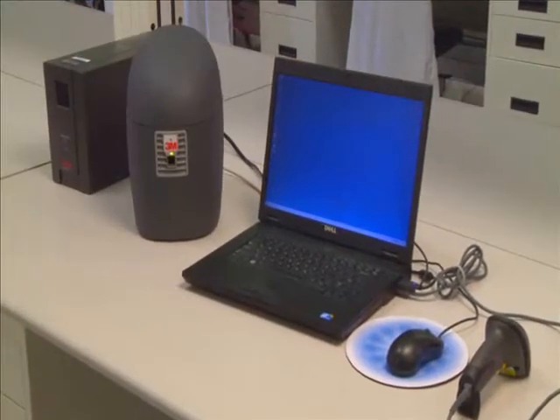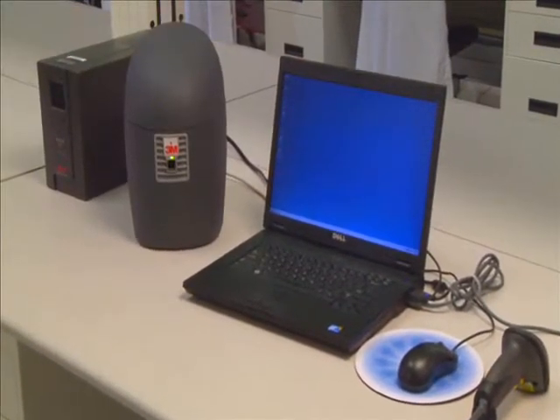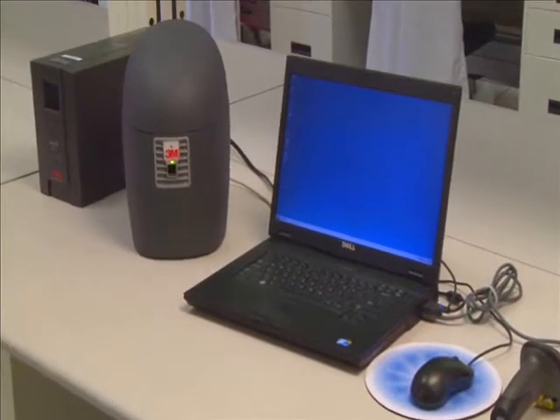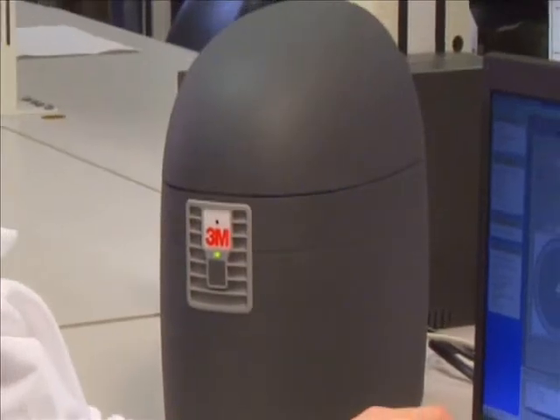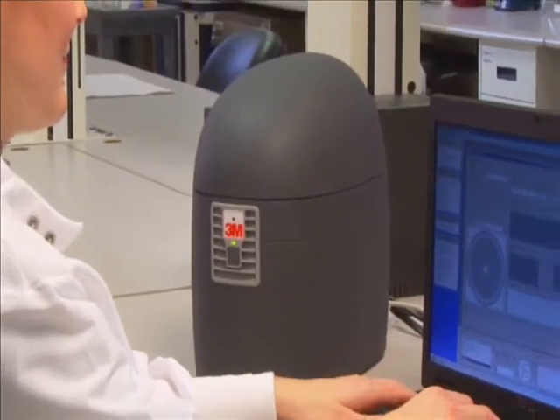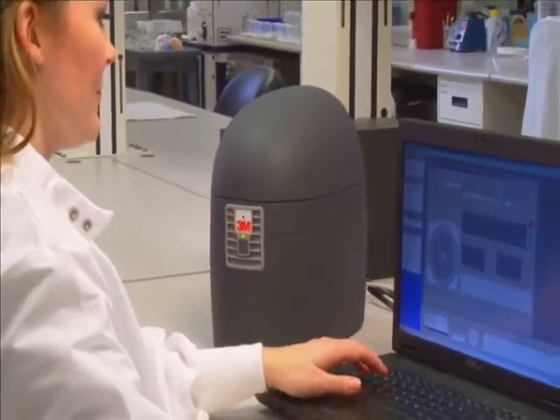Backed by thousands of test runs within Quest Diagnostics' own labs, 30 unique patents, and capable of running a broad menu of chemistries, the Integrated Cycler is a fully integrated molecular testing system that will change the way you think about molecular testing.